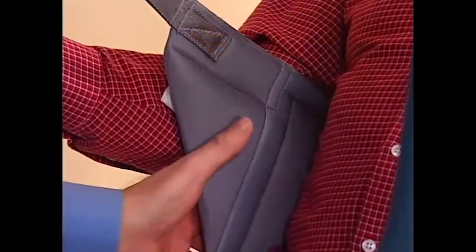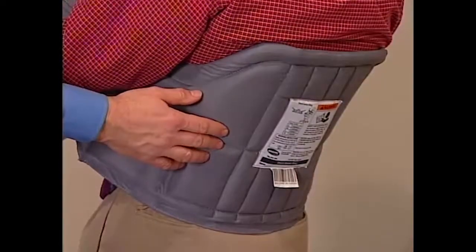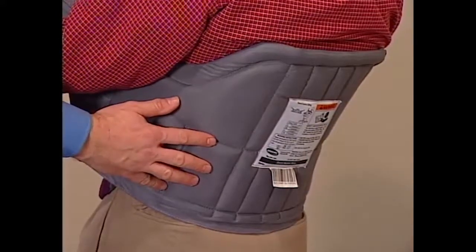The soft brushed lining helps prevent sliding for comfort and skin protection. And its stretch-resistant character helps them hold their shape for superior comfort and ease of positioning.